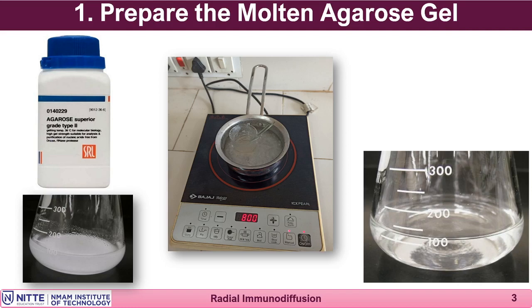Either you use a water bath as a precautionary measure and keep the agarose that is mixed in the buffer in the boiling water bath. As the water starts boiling, the agarose will start melting. And once it melts completely, there will be no particles in the buffer and it will be a transparent solution. The 2% agarose solution prepared in this manner is now ready to be used for the preparation of slides. See that there are no particles in the agarose that is dissolved in the buffer.